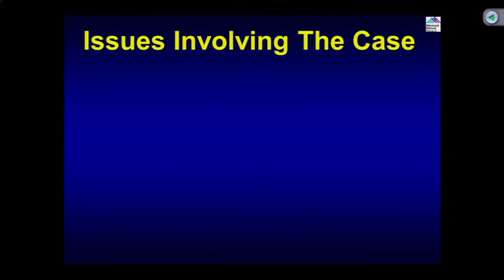So now, you want to do the FFR of the circumflex? We'll do it. Yeah. As you're talking. So we are going to do now the FFR of the circumflex while we continue. What's the ACT? Okay, we are waiting for the ACT now.